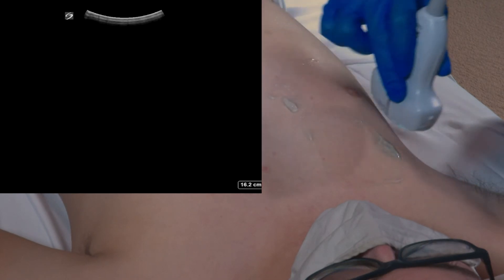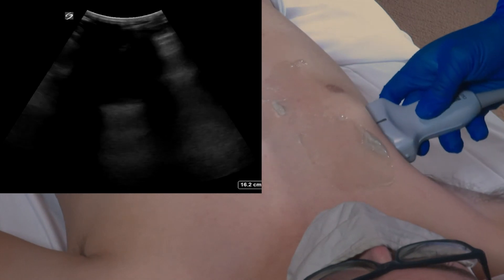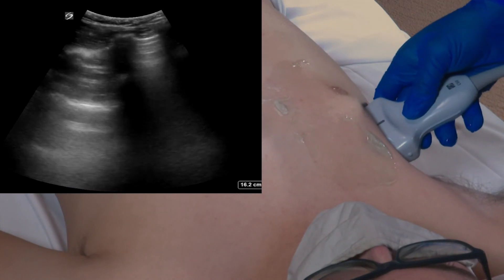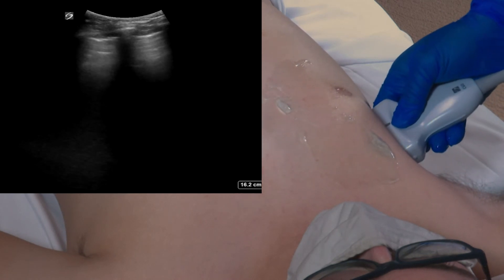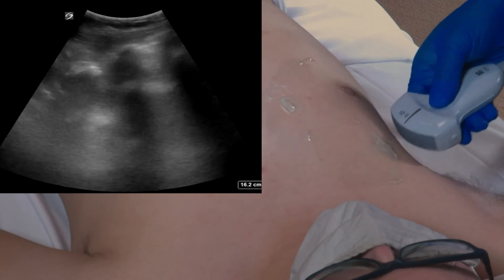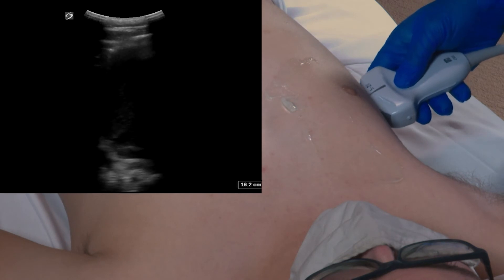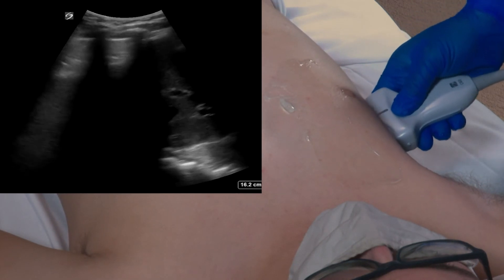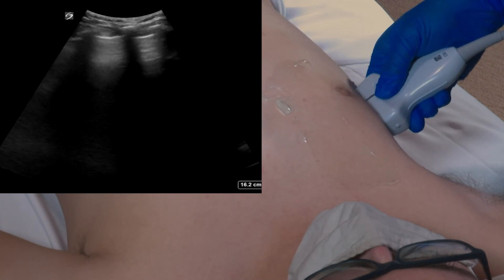Next we will move into Zone 3. We are going to move the transducer on the chest wall throughout that zone looking for any evidence of B lines. Finally we are going to look in Zone 4, which is the lateral inferior zone, and move the transducer throughout that zone looking for any B lines that may be present.